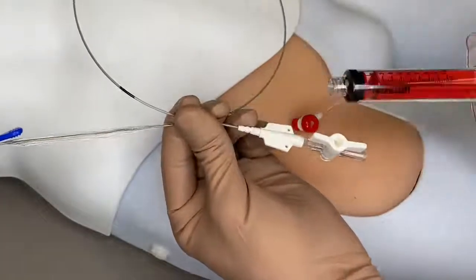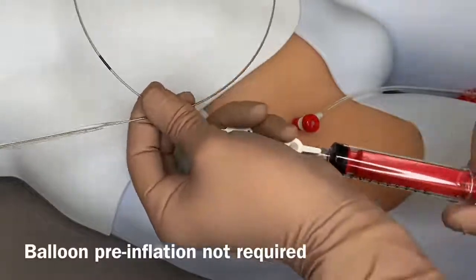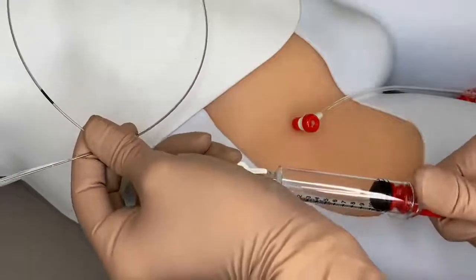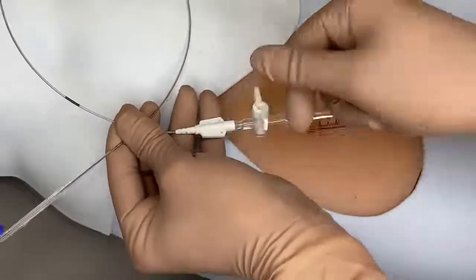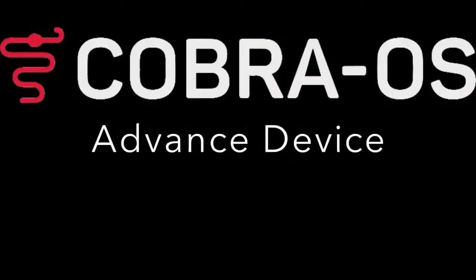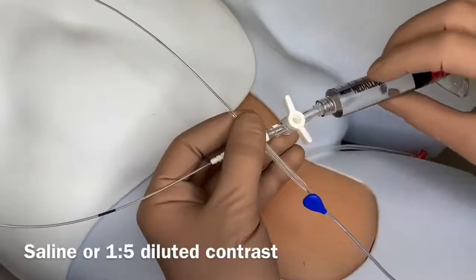Attach the empty syringe to the stopcock and purge air from the balloon. Note that the syringe can be locked to keep continuous suction. Close off the stopcock. Connect the syringe with inflation medium to the stopcock.